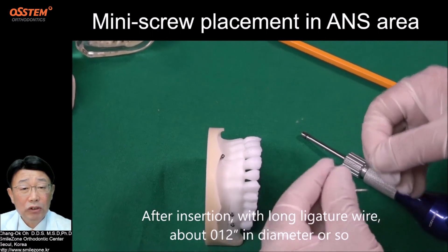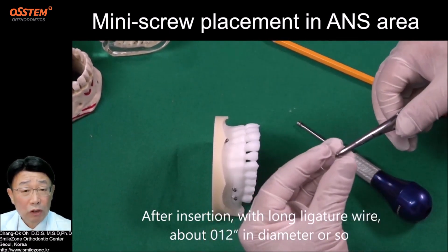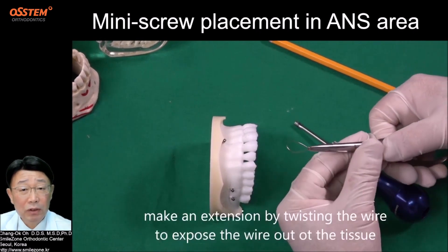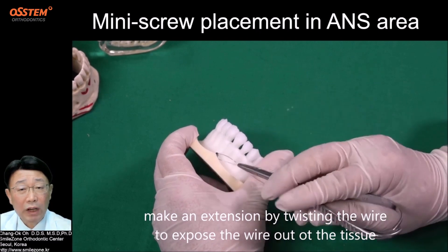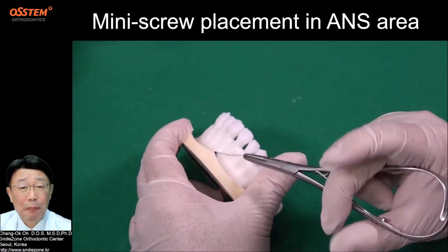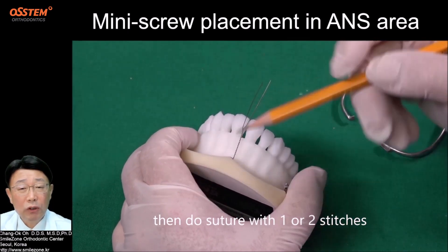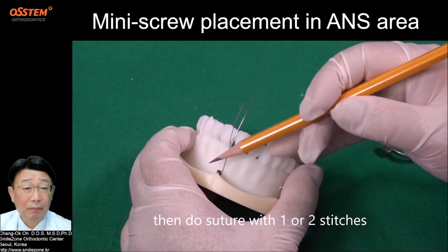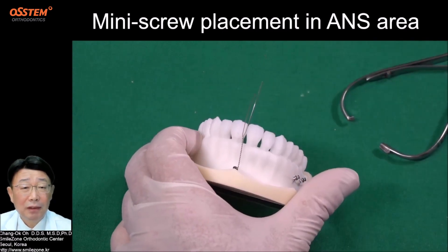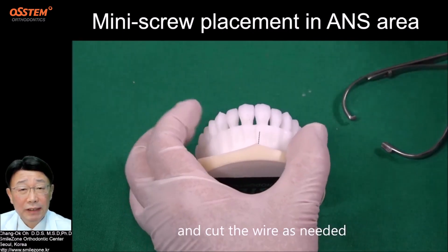After insertion, using a long ligature wire about 0.012 inch in diameter, make an extension by twisting the wire to expose it out of the tissue. Then do a suture with one or two stitches, and cut the wire as needed.